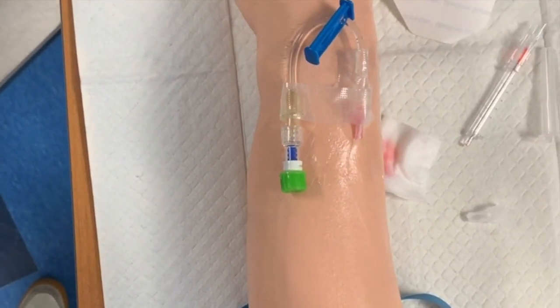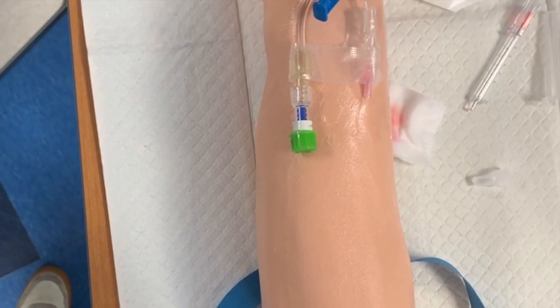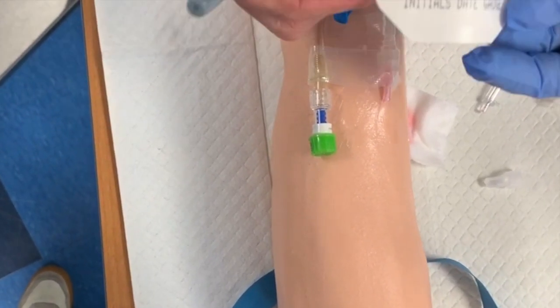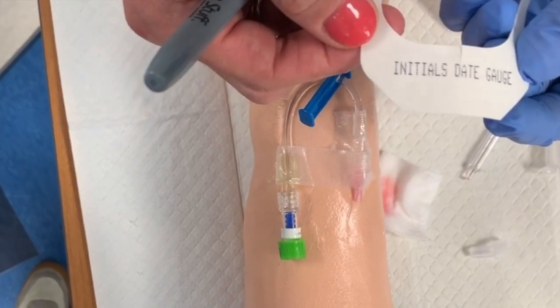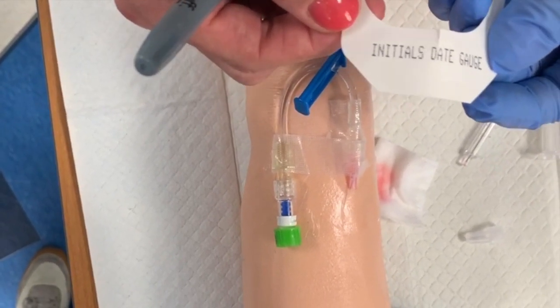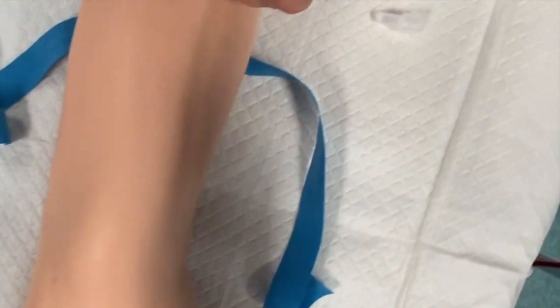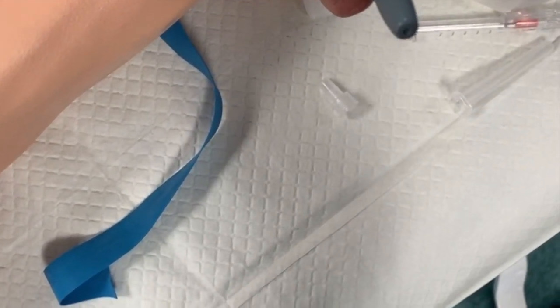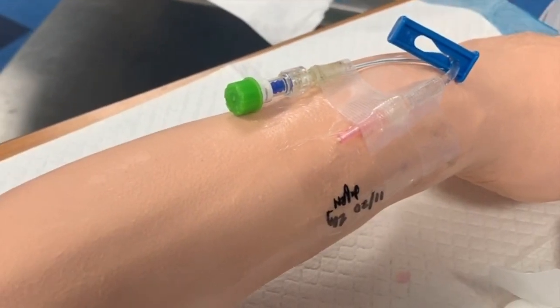Now, before we're done, we want to make sure that we date our IV. Now, our Tegaderms always come with a little label like this. I personally don't like to use these because they can flake off and then your IV is non-dated. So I like to come over and on the edge of my Tegaderm, I'll write the date, the size, in case somebody doesn't know their colors, and then my initials. And I'll date it right along the Tegaderm here, so that identifies it very easily.